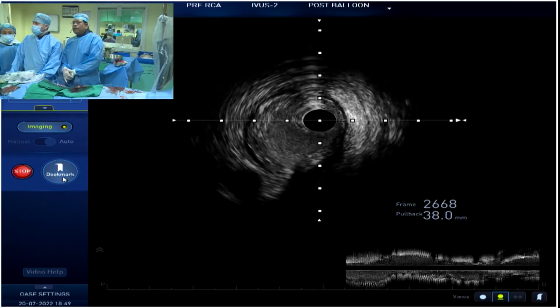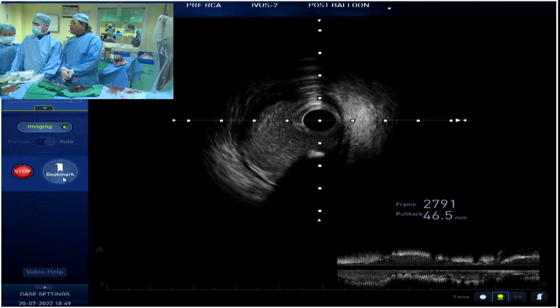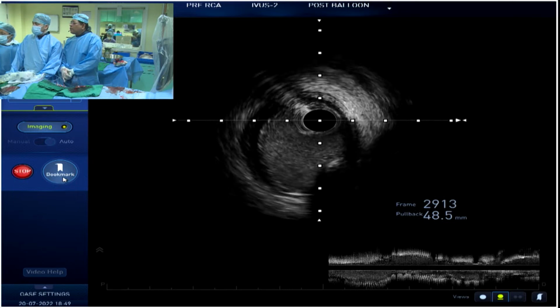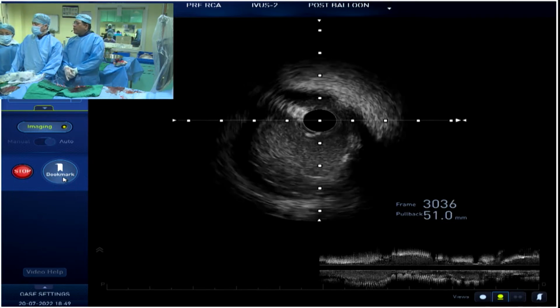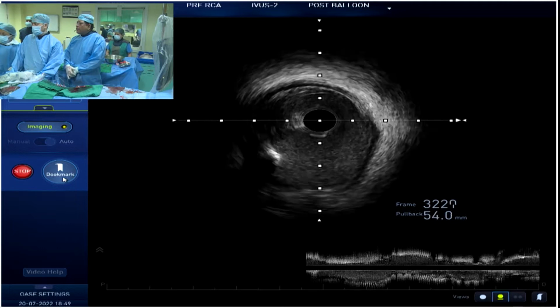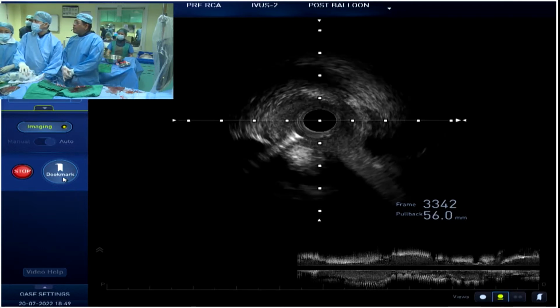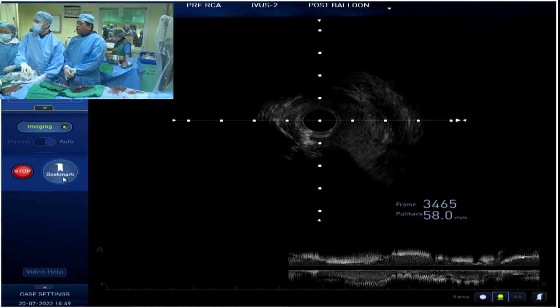Here there is a plaque, proximal RCA, and here I think our catheter was abutting, and we were not getting good pressure, dampening was there. But the MLA was not very bad. We'll measure it out. So the ostial, this is the ostial segment. There is some disease. Okay, so there is ostial plaquing as well.